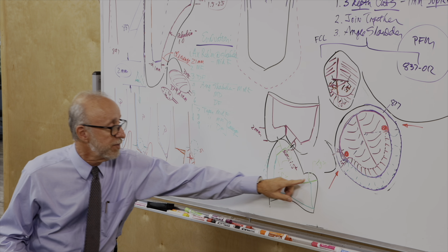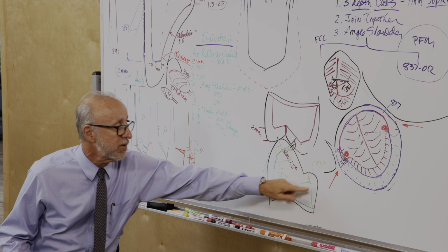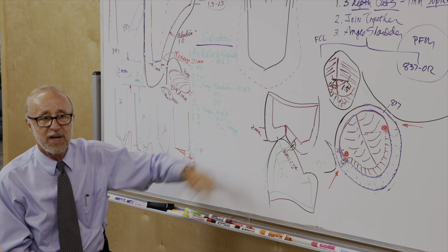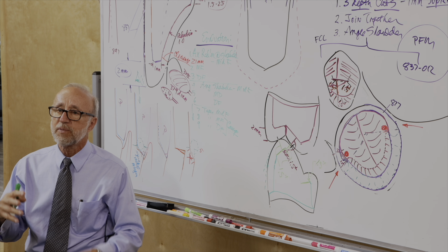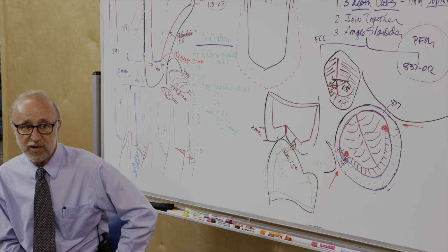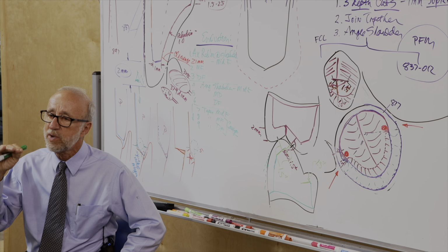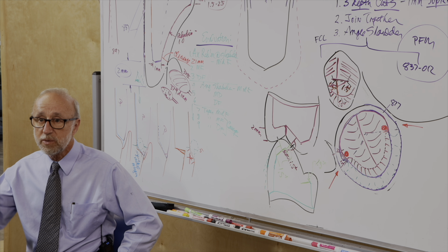Again, when you have a little short cusp that's not in occlusion, we're certainly going to reduce it so we can get lots of metal and porcelain over there. We're going to make sure we get the aesthetic reduction on the facial cusp on the maxillary. Get enough clearance so we're getting a thin layer of metal and plenty of porcelain, so we don't have to worry about the porcelain being weak or breaking in those areas. But at least 1.5 millimeters. We've been a little bit less than 1.5 millimeters on our gold crowns, but we can definitely go a little bit more. We might even say 1.5 to 2.